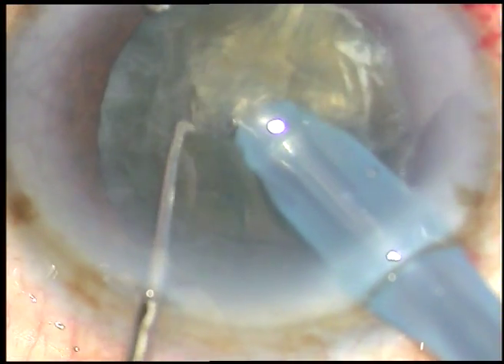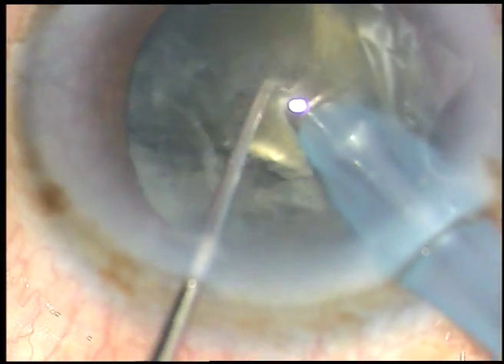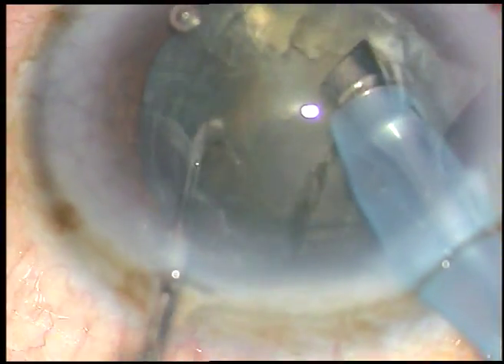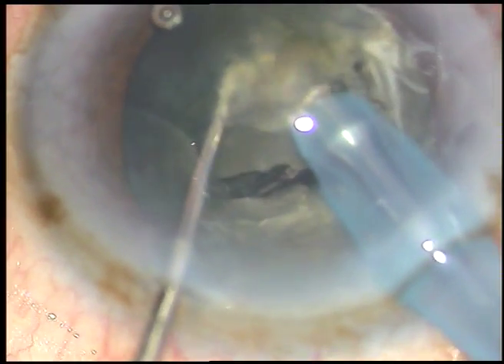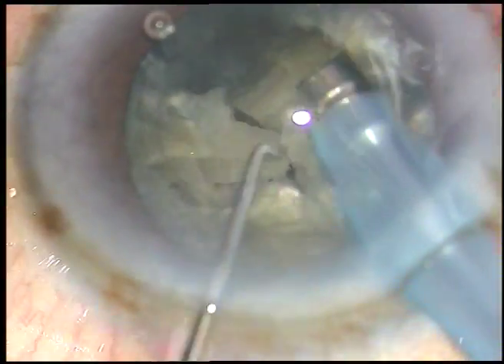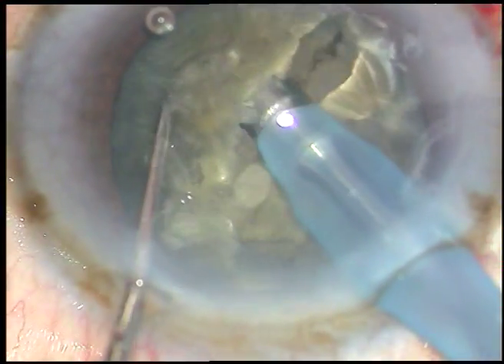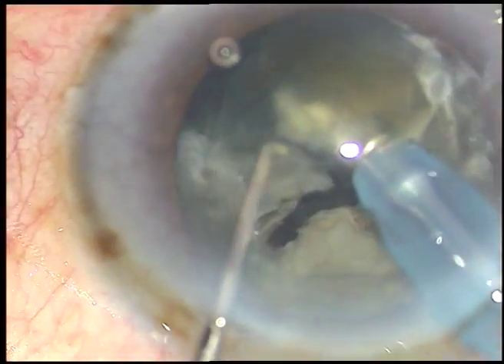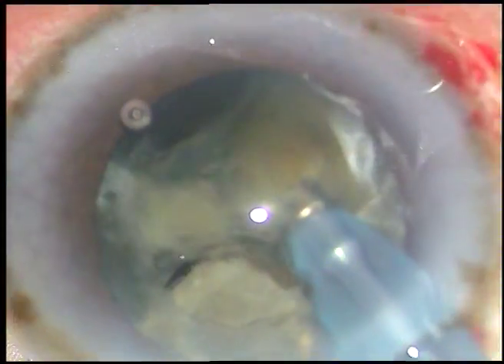Reaching near the opposite equator, the chopper divides the nucleus into two halves. Going through the nucleus means you are at a sufficiently deep level and you can divide the nucleus in one go — no need of trenching, no need of stop-and-chop — just go through the nucleus and chop it into two halves, then divide the other parts of the nucleus into several fragments.